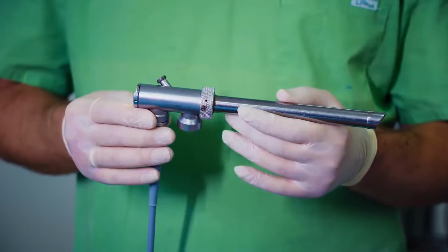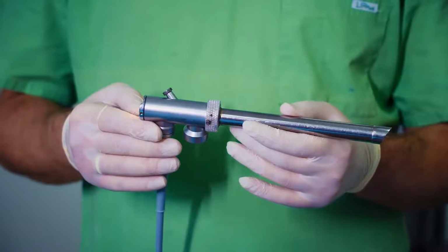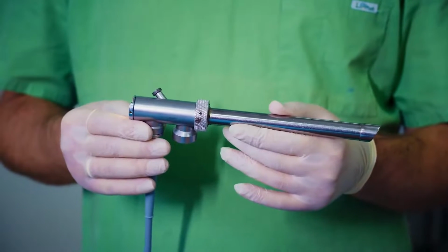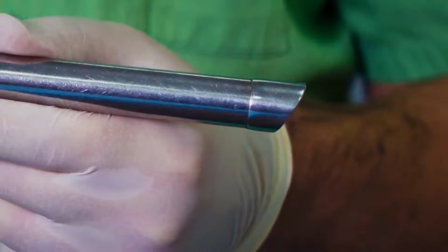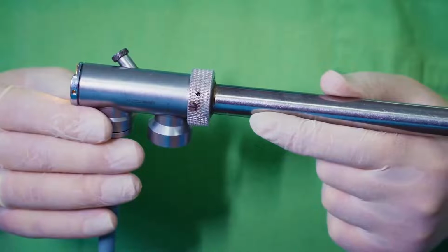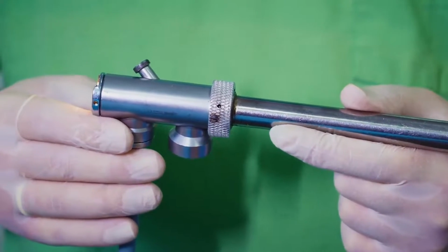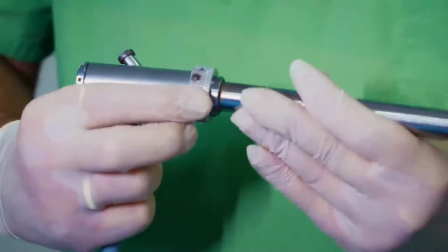The rigid tube for laryngoscopy is a 15 to 25 centimeters long, straight, hollow tube, round in shape, with a diameter of 5 to 20 millimeters and a bevel end distally. An intermediate piece that has a prismatic light deflector with a connection to a light source is attached to the proximal end of the rigid tube. When in use, the image is obtained directly looking through this assemble.